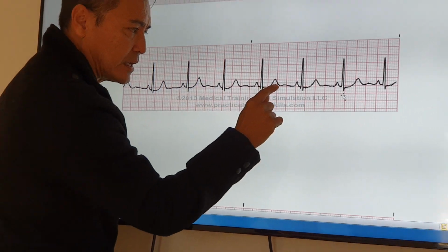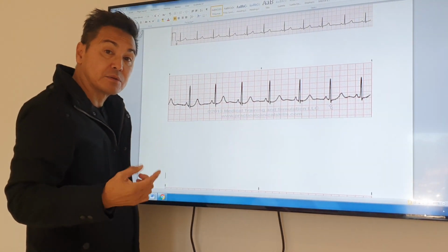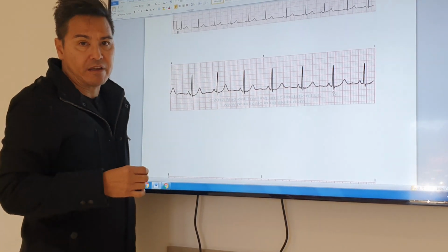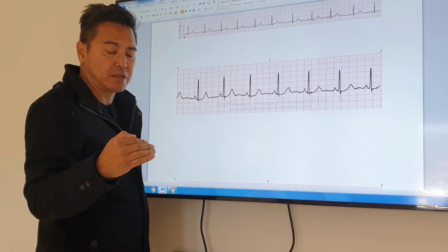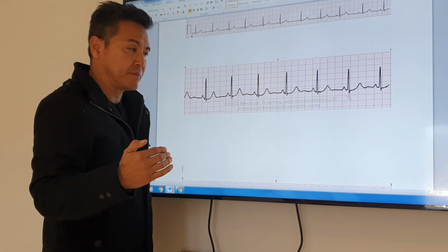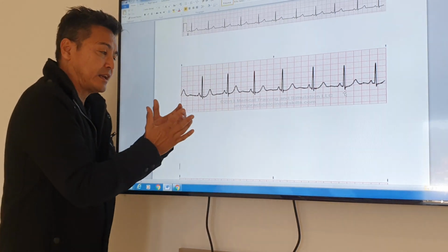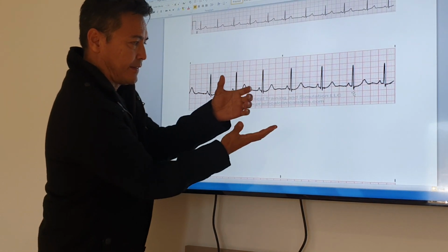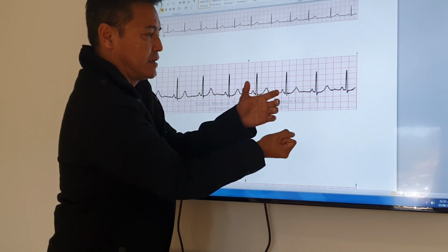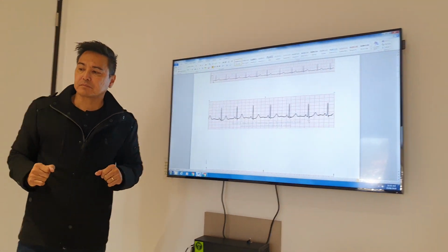So when we're looking at cardiac rhythms, one of the first things that we look for is the presence of the P wave, because the P wave tells us that the sinoatrial node is working, and it should be. That's its job, okay? So I'm going to convert that into a mechanical event now, right? So PQRST, and that's how it pumps, okay? Okay, so that's all well and good, okay?